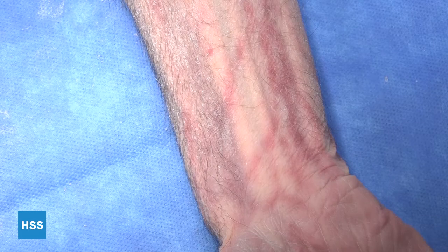Hi, my name is Joshua Wright Chisholm. I'm one of the PGY-5s here at Hospital for Special Surgery, and today we'll be demonstrating the Volar-Henry approach for fixing distal radius fractures. This is the workhorse approach for almost all distal radius fractures, and we'll start by first identifying our landmarks.